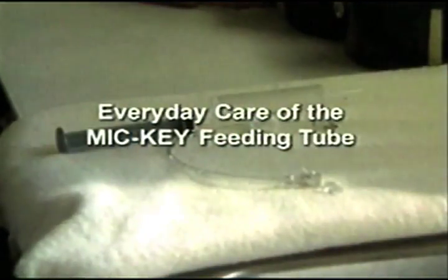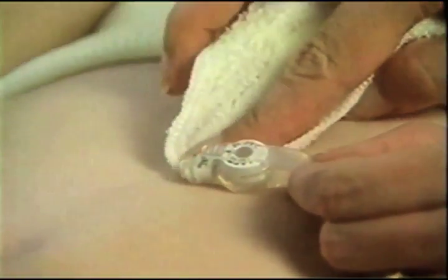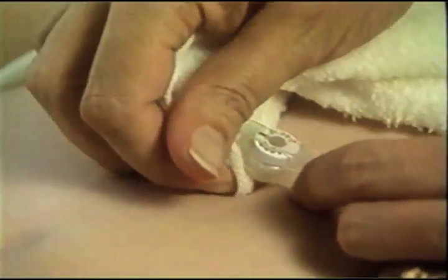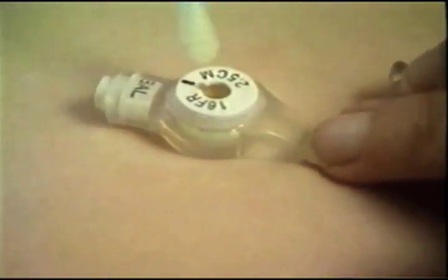There are a few things you need to do in the way of everyday care of the Mickey feeding tube. Most of it is common sense. In order to prolong tube life and help prevent infection at the stoma site, be sure you maintain the cleanliness of the Mickey feeding tube and the skin around the stoma. Remember to clean the anti-reflux valve to keep it functioning properly. A cotton-tipped applicator works well.